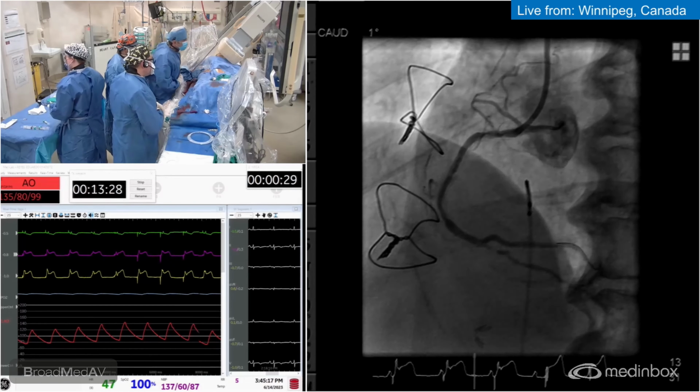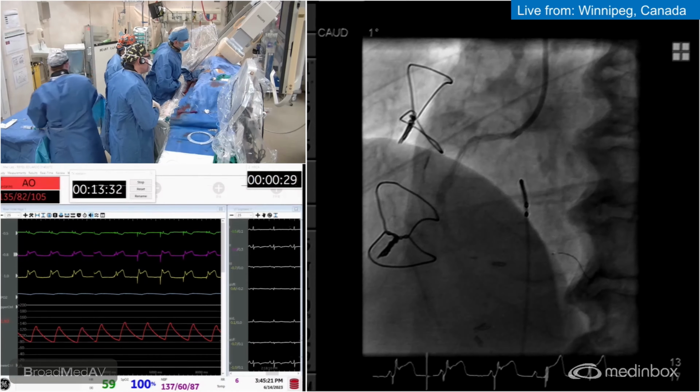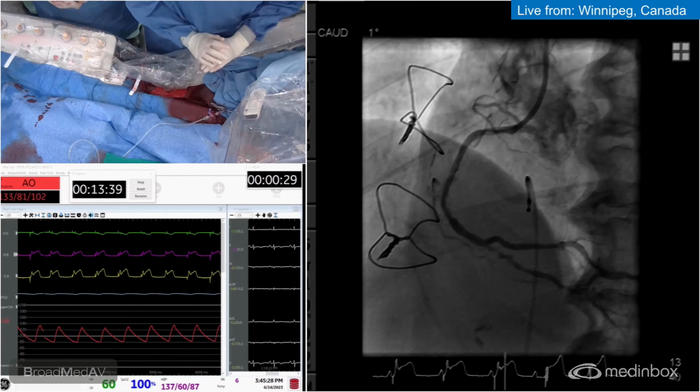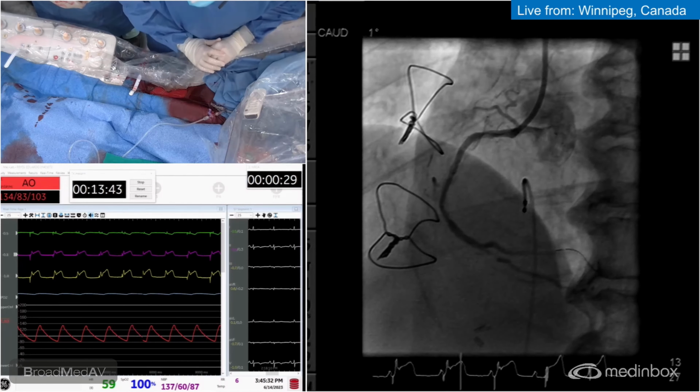So are we getting the adenosine? So we're getting some no reflow meds. We usually give adenosine, we've got a pace wire here, so it shouldn't be an issue. If we had poor flow, we might use a microcatheter to deliver it more distally. Also, give me the Beamer as well, please. There we go. Do you have the Beamer?